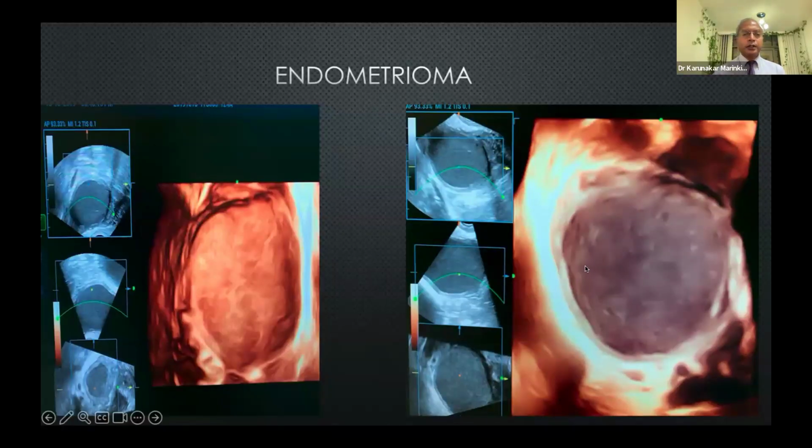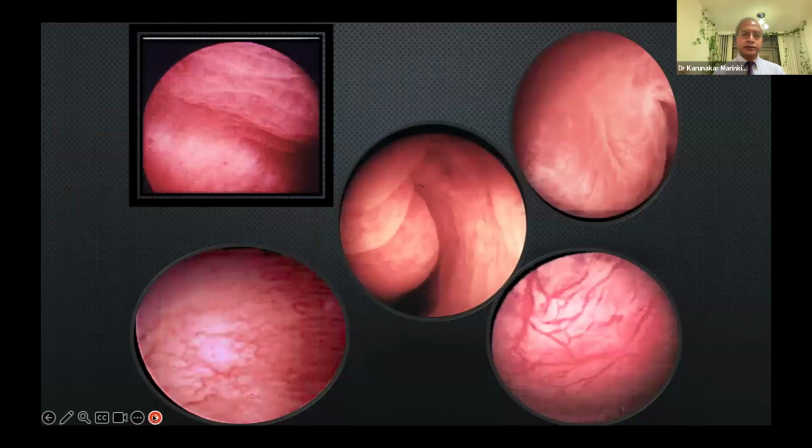Yeah. So before I go to endometrioma, I just wanted to highlight this slide that I just transferred from my hysteroscopy lecture. I was talking about myoma, and there are many people listening who do myomectomy for infertility. Typically, the luteal phase endometrium, this is the anterior wall, that's the fundus, as you can see. It should be this level.